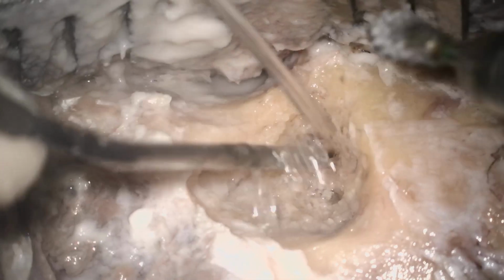Now we are continuing with the dissection. Okay, one second. The sucker has been blocked. This is a very common thing when you are drilling the cortical bone, as there are large bone chips, so it very commonly gets blocked.